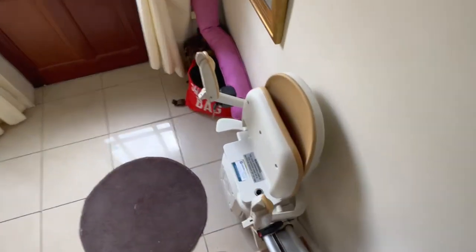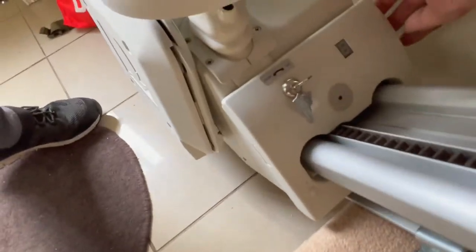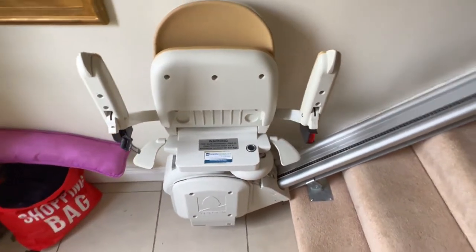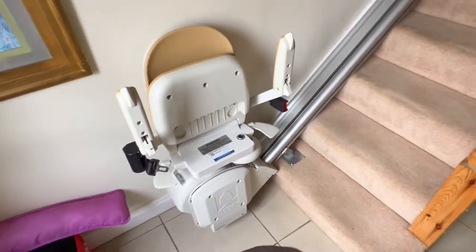Stair lifts run on batteries — two 12-volt batteries, which are a common part that stair lift engineers can get relatively easily. You would usually get multiple return trips up and down before the batteries reach a level where you can no longer use the stair lift.